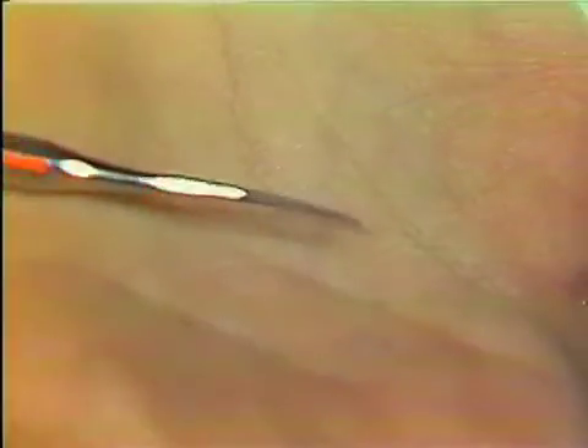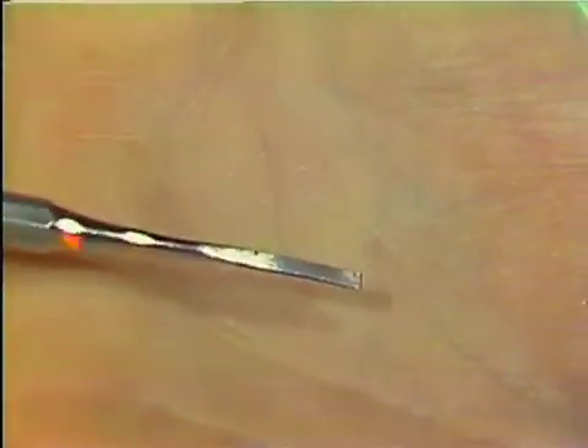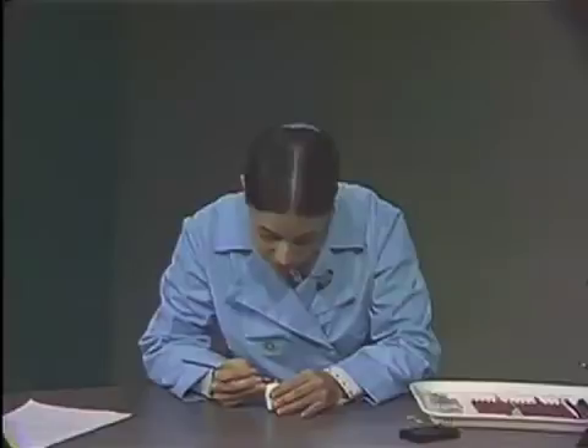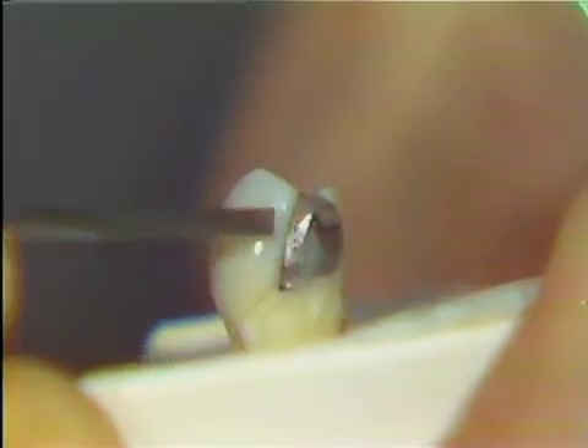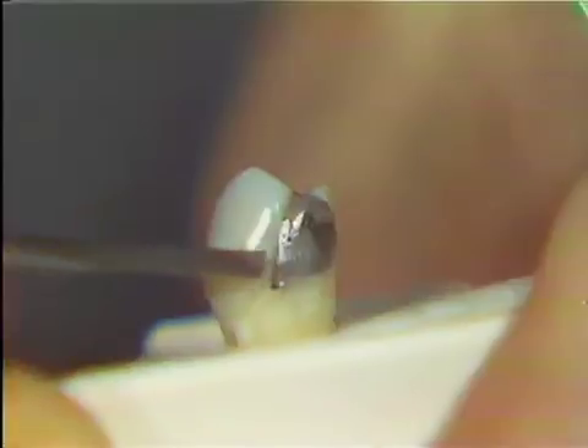Take a look at this instrument — it's a chisel, with a rather long, flat blade. This instrument is used with a push stroke, unlike your scalers or your Rhein trimmer, which need a pull stroke to be effective. Now let's move to the amalgam, and I'll demonstrate how it is used. You can see that I'm pushing against the margin of the amalgam restoration. Amalgam is being removed, but the margins are being smoothed.